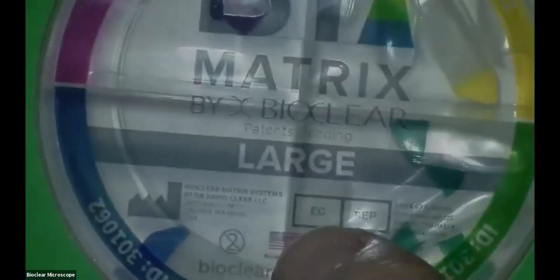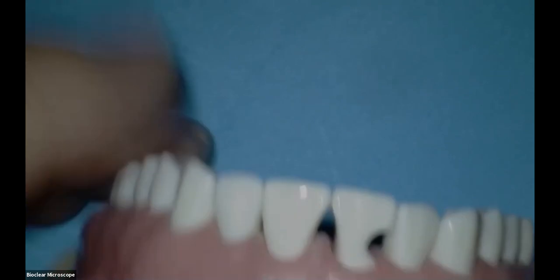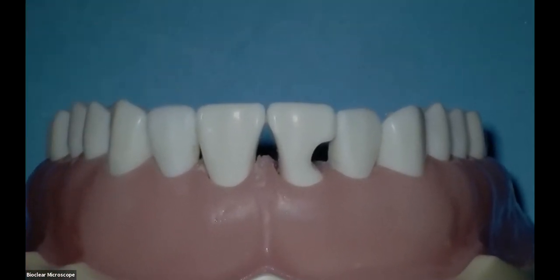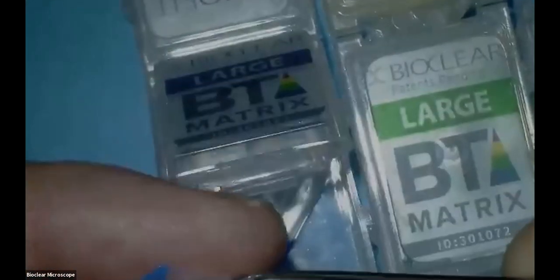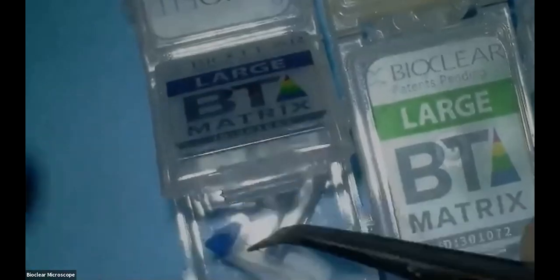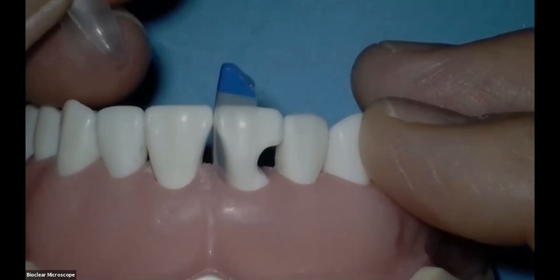So in this case, we're going to use the large matrices, and I'm going to be using a pair of the blue matrices here. Now, this is a really fun exercise to do. And we want to set up live remote hands-on classes in India like we do in the United States, where you have a chance to injection mold with these new exciting black triangle matrices that are custom built for black triangles. So I'm going to use a pair of the blue matrices, and you always have to slide them in at about a 45 degree angle because of the curvature. And then I'll slide another blue one in like so.